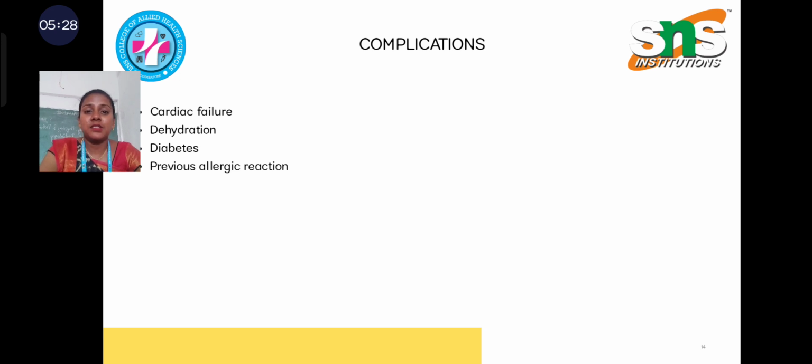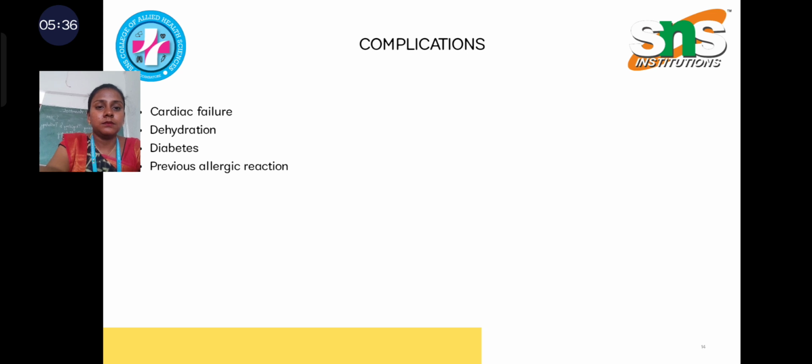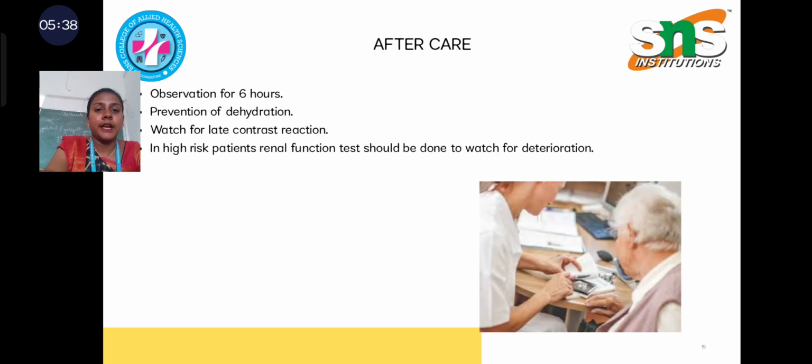The complications will be cardiac failure, dehydration, diabetes, previous allergic reaction. Aftercare: observation for 6 hours, prevention of dehydration, watch for late contrast reaction. In a high-risk patient, a renal function test should be done to watch for deterioration.